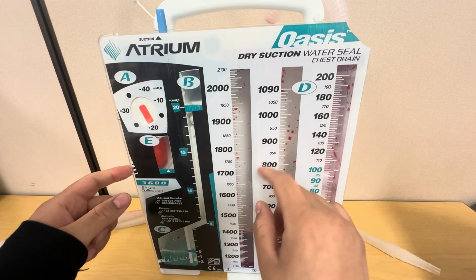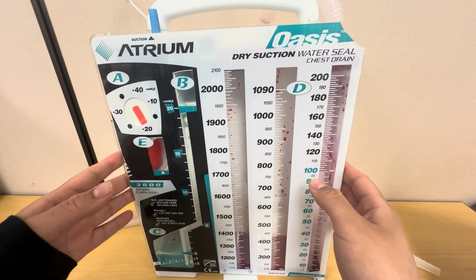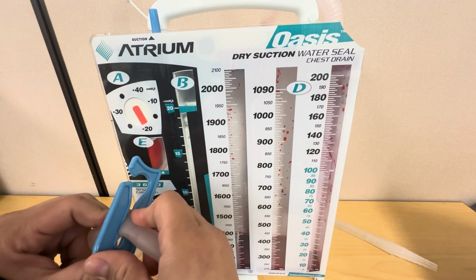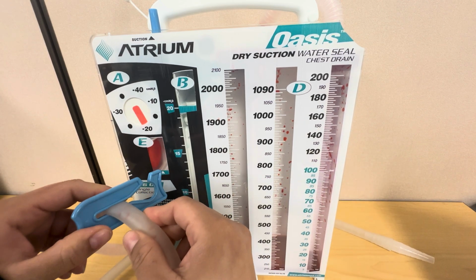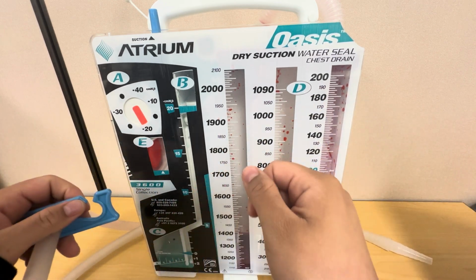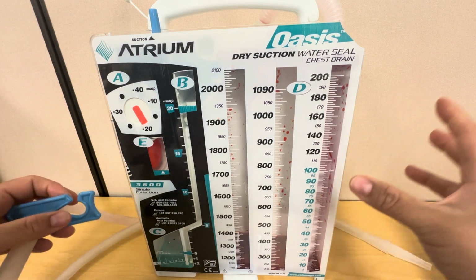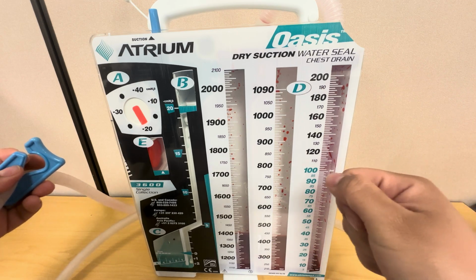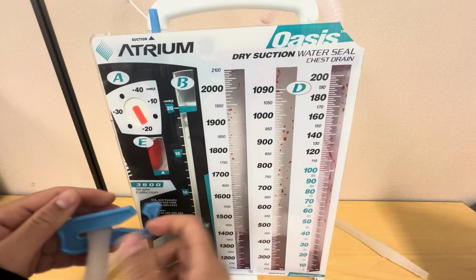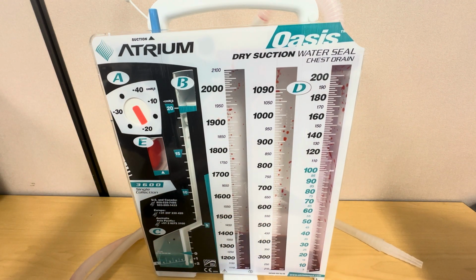If this were to become full and we need to change the drainage system in general, what we need to do is go ahead and clamp this. Make sure this is clamped before actually removing anything, otherwise we're going to have a big mess. So we'll go ahead and remove that, and we'll want to make sure that we have our drainage system ready to reattach. So we never want to just take it out and then not have it. So then we'll go ahead and reattach it, unclamp it, and continue suctioning.